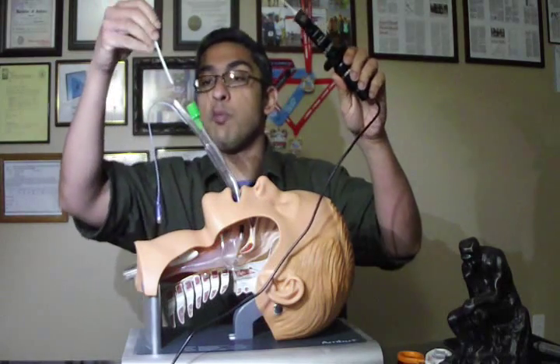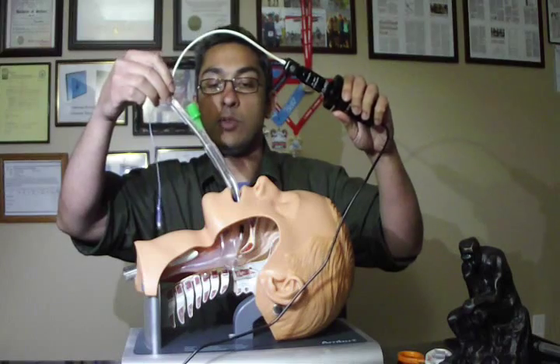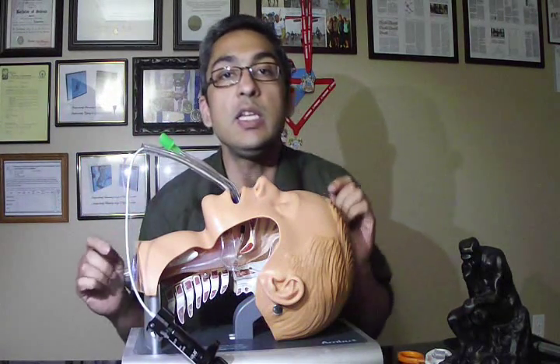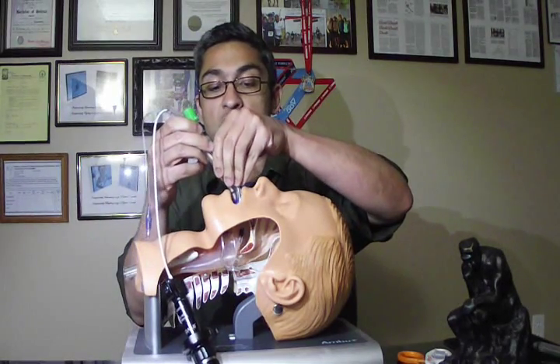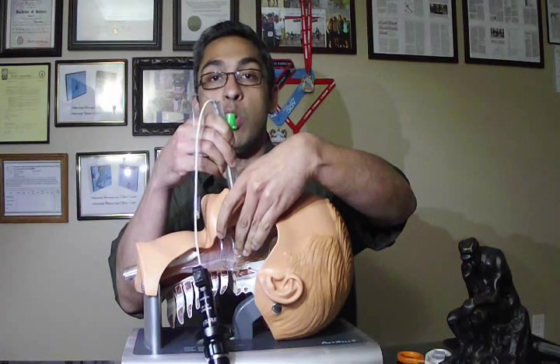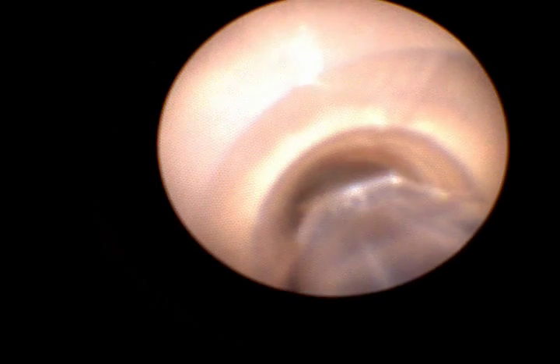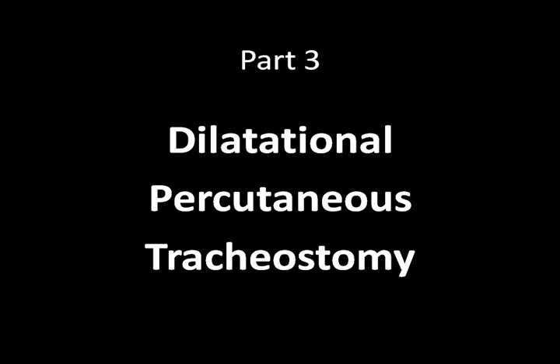Take your time to put a bronchoscope through the viewing tube, and as soon as it reaches the end, place the bronchoscope down. From now you do not need any separate operator for the bronchoscope because you will be just adjusting the viewing apparatus itself to reach where you want. As soon as we look through the bronchoscope, we see that we are already at the glottic opening. Push the viewing tube just behind the glottic opening and inflate the balloon so that it stays there. You can push the ventilation tube in to have space to do your tracheostomy and pull it back when you want to insert the tracheal tube. The anterior wall of the trachea is always visible and in a very good view.